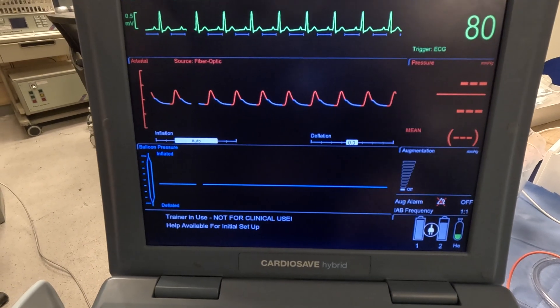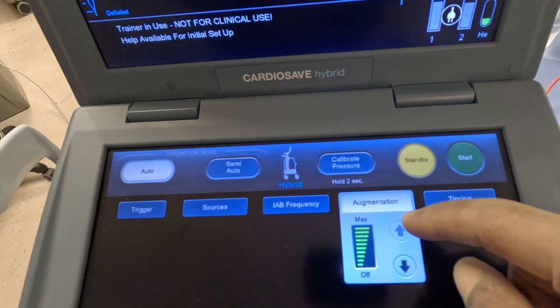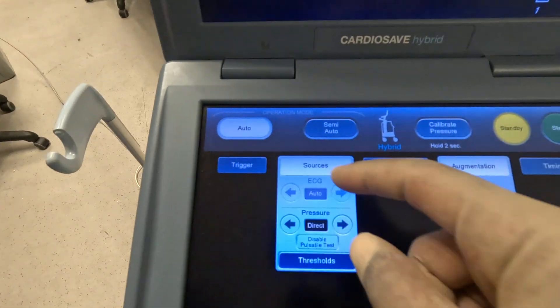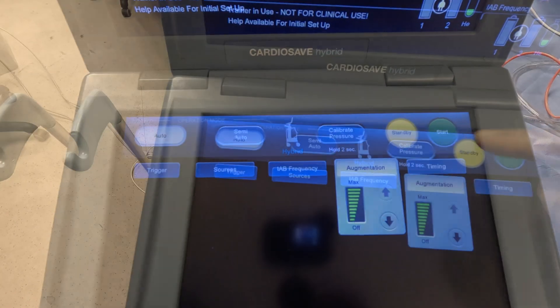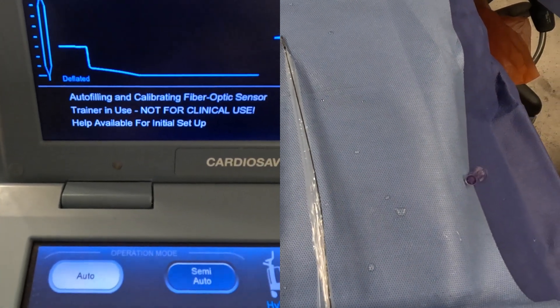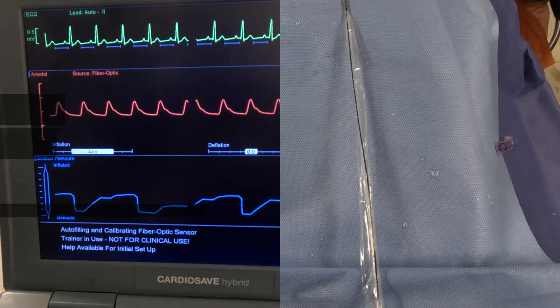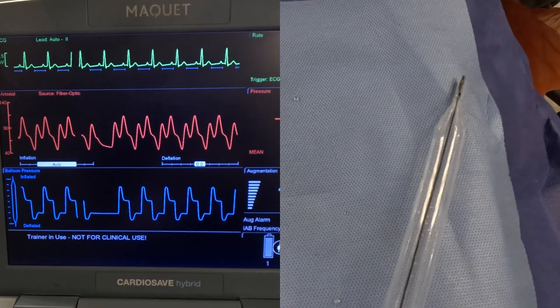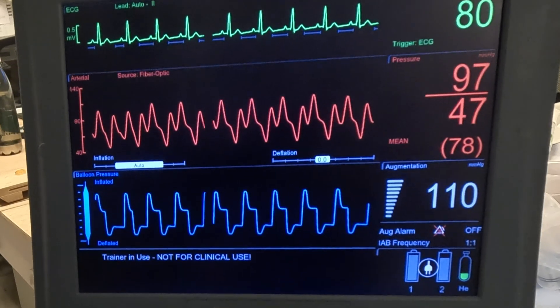Once connected properly, the console will display the ECG and pressure waveform — make sure the setting is at auto. Usually started at a 1:1 ratio with maximum augmentation. The console will initiate counterpulsation by inflating and deflating the balloon in synchronization with the cardiac cycle: inflating during diastole to increase coronary perfusion, and deflating just before systole to reduce afterload and improve cardiac output.